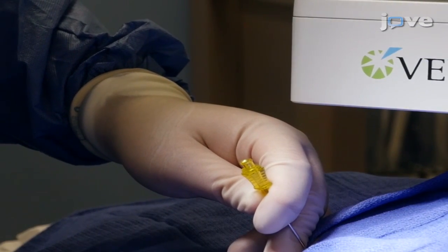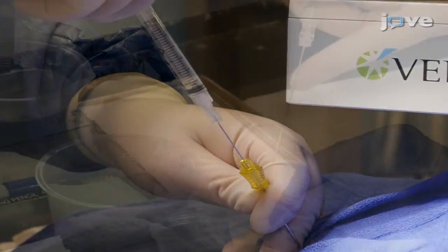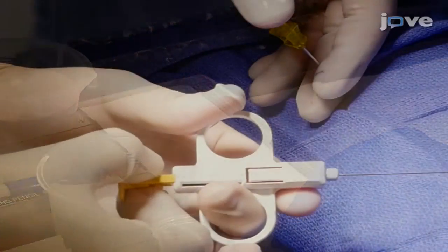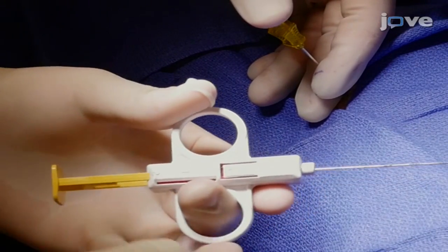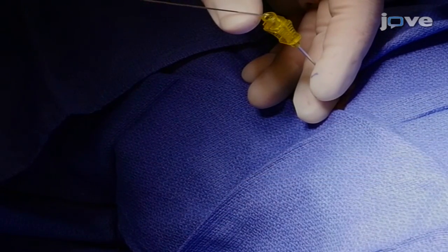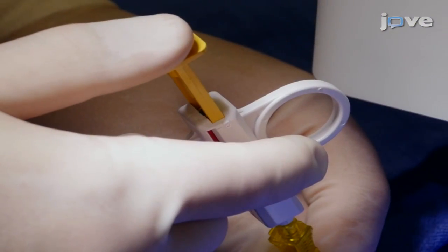Insert the 20-gauge FNA needle through the 19-gauge needle. Sample the lesion and provide the specimen to the cytotechnologist for rapid on-site evaluation. Program the automatic needle biopsy to the desired distance or selected length of the biopsy needle based on the size of the lesion. Then insert the biopsy needle through the 19-gauge needle.